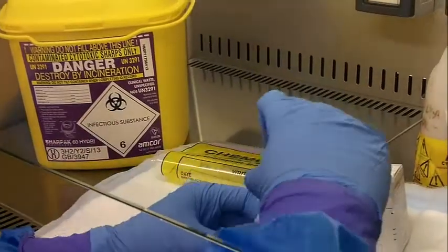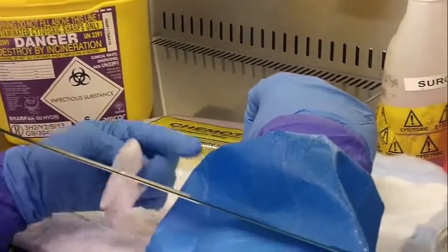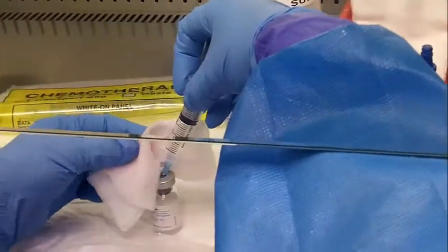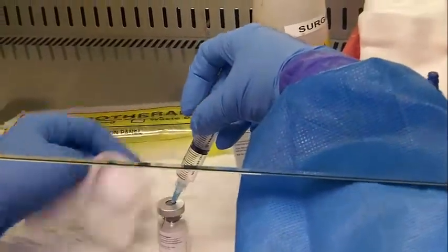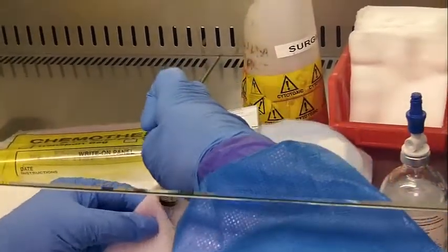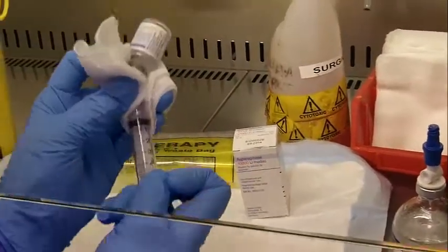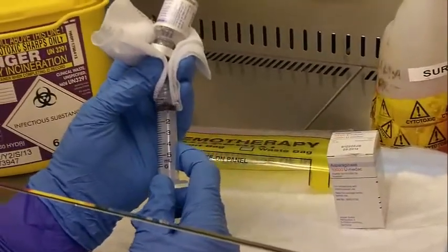That's fine. The next thing I want to do, to ease drawing out the liquid, is put the air back into the pot. This is just air that's been expelled when I've put the liquid in. So I'll put the air back in, and then we want to tip it upside down, wrapping our swab in place, and start sucking out the liquid.